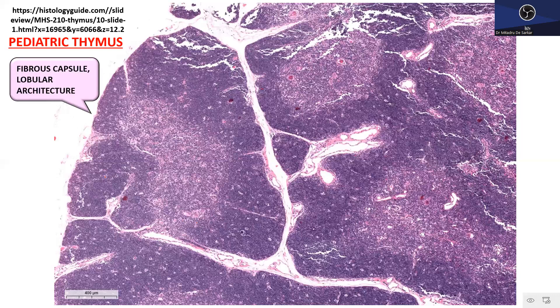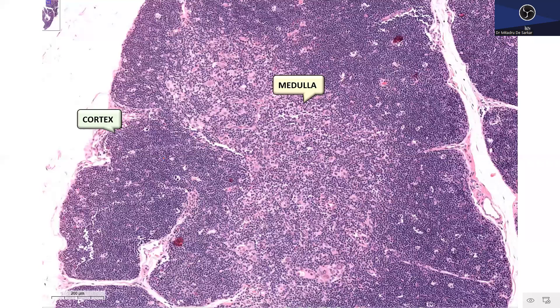Looking at the thymic histology, you can see two zones: an outer dark zone — the cortex — and an inner zone composed of slightly more spaced-apart cells giving a paler appearance — the medulla. In the cortex there is a starry sky pattern, indicating a lot of proliferative activity, with lots of sheets of immature lymphoid cells that have the same immunophenotype as T-acute lymphoblastic lymphoma.